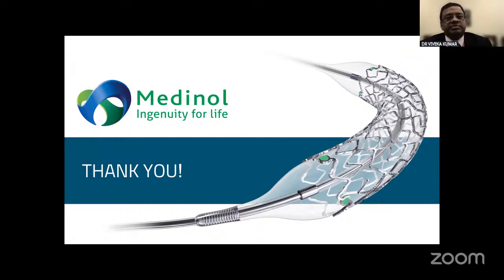Thank you, Doctor. That was a very comprehensive overview, and it stands out as a different kind of drug-eluting stent, which has deliverability plus the strut-to-metal ratio is quite favorable, and the 24 months data is also quite impressive. I believe it is FDA approved also, so that makes it even more acceptable for the international market. Yeah. Amit, any comment?